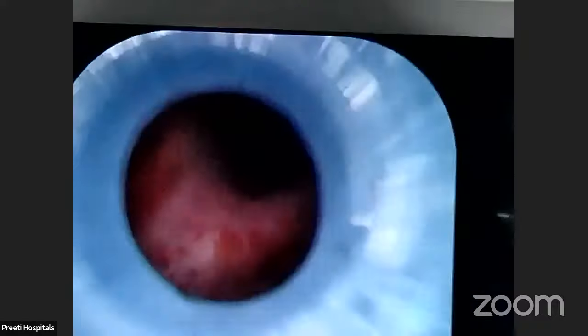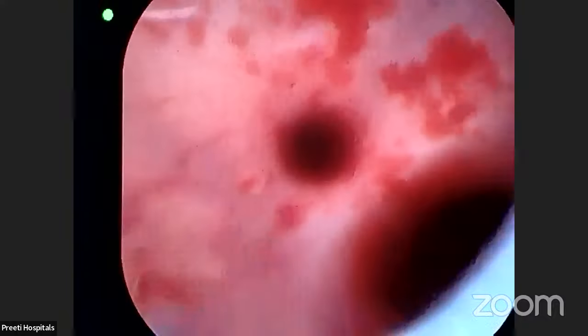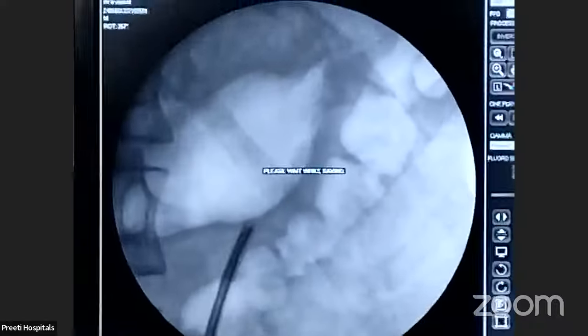When you are pushing, always, Dr. Kaushik Shah says, push now. Push, yeah, push, push. Like this you push. Don't push blindly. In fact, in the initial part we pushed because it was not going. Now I will inject contrast. You watch, nothing will be there. Now see, thick contrast you should give.